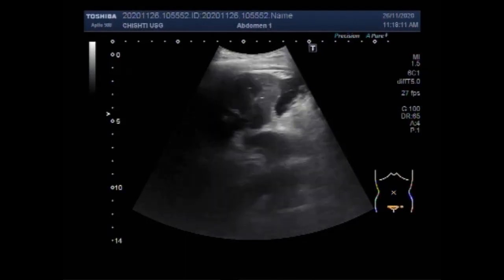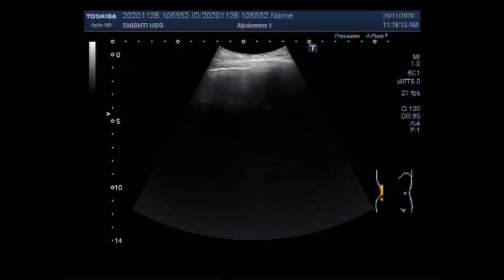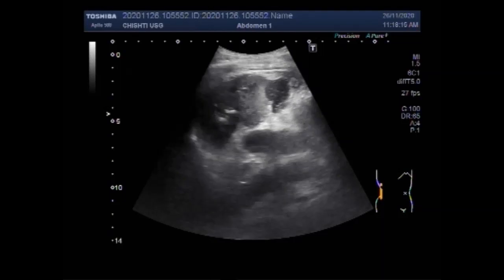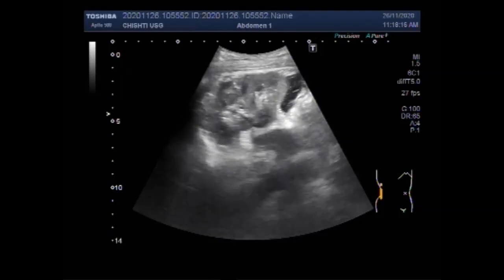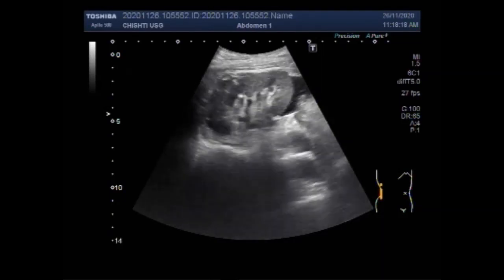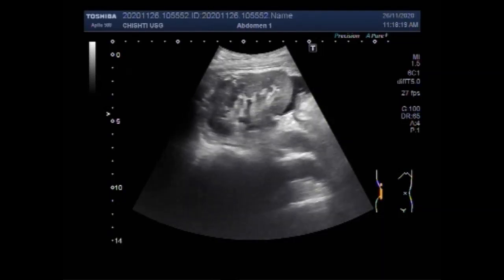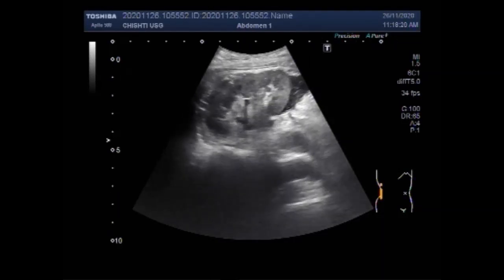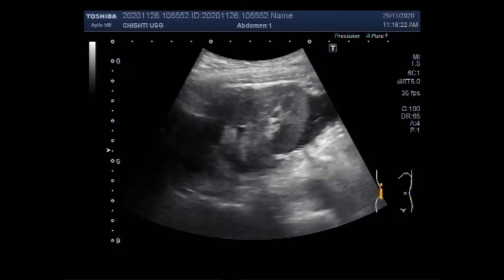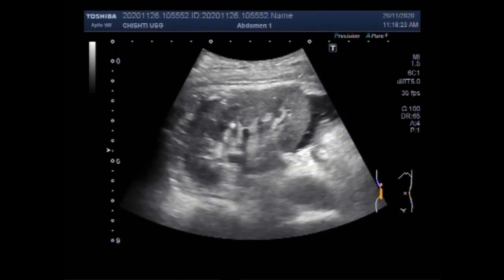I hope you are all fine. This ultrasound video shows fluid in the perinephric space with benign prostatic hypertrophy.